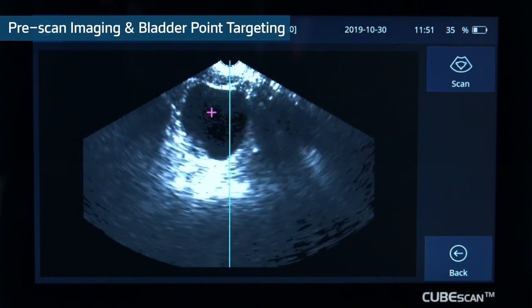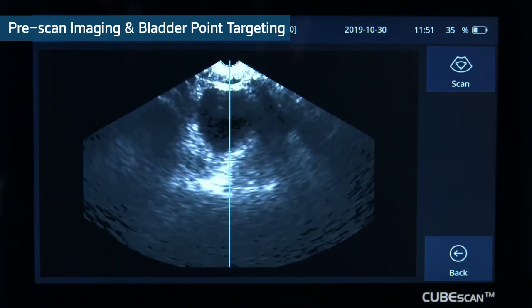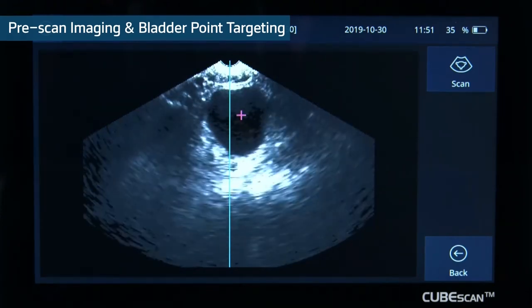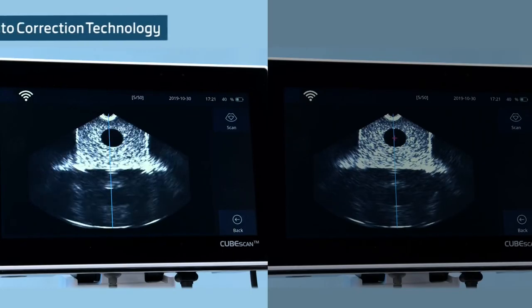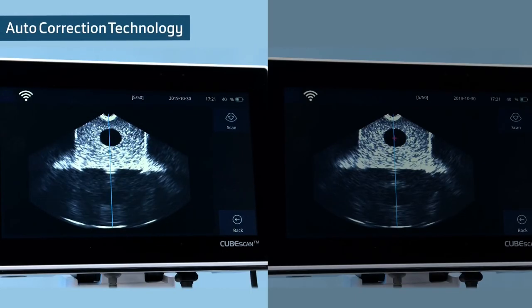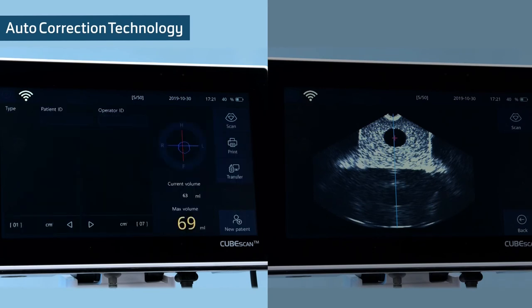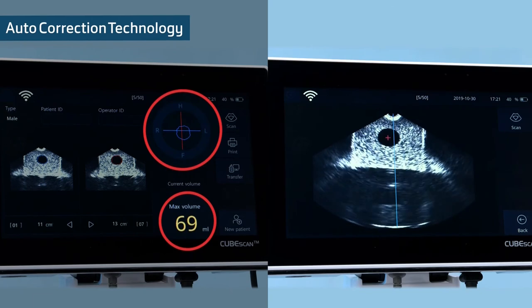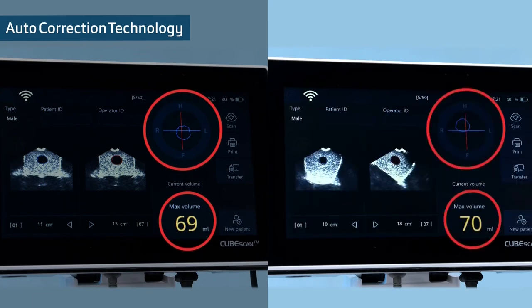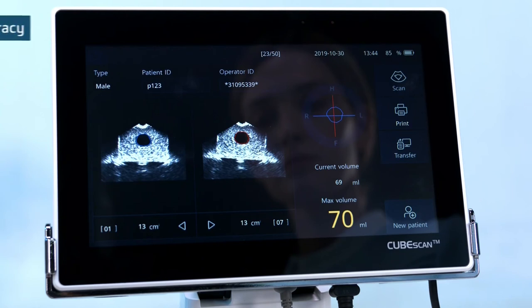Pre-scan and bladder point: the live image of pre-scan and bladder point leads to short scan time. By using 3D volume estimation modeling, bladder volume is accurately calculated even in cases of off-center scans. High accuracy: the highest industry accuracy of plus or minus 7.5% enables more accurate scanning.